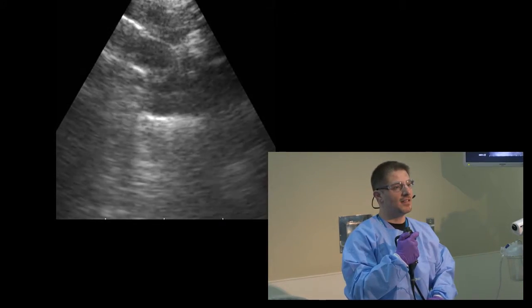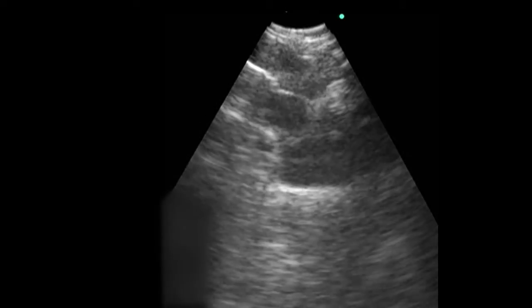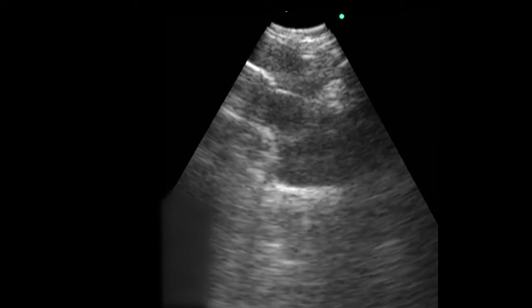Then you can freeze. And we'll do the measurement now. We go for the short axis measurement. In this case, the lymph node 11L is 6.1. Would you capture, please?